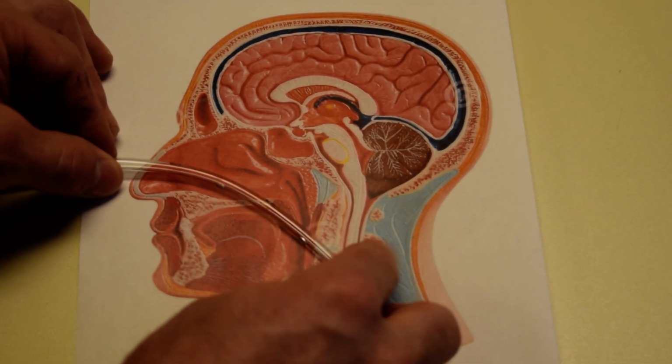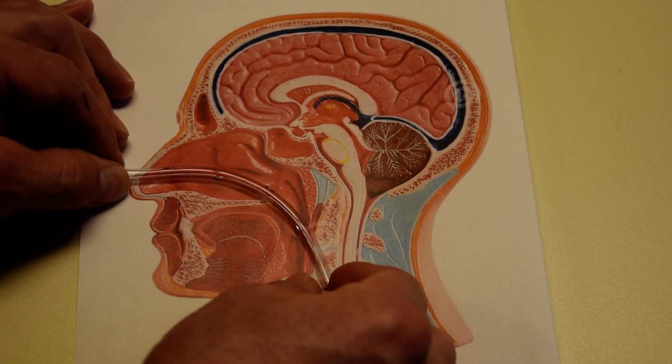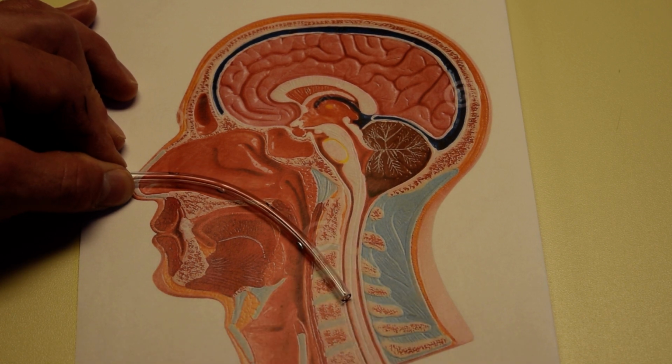Once you have achieved that, at that point, it is appropriate to stop and check in with your patient. Are you okay? Is this going all right? You're doing awesome. We're almost there. That was the hardest part.